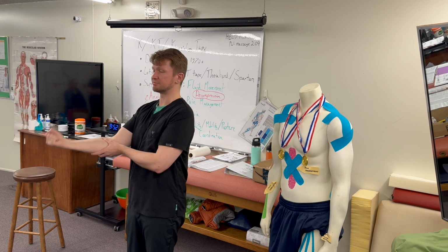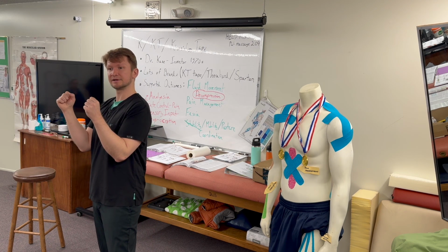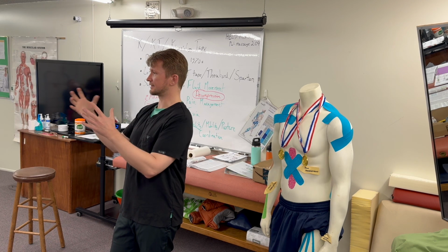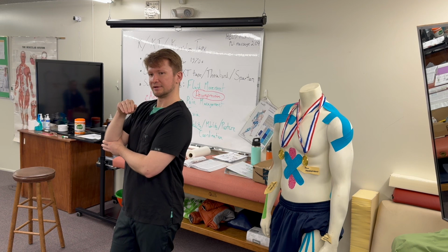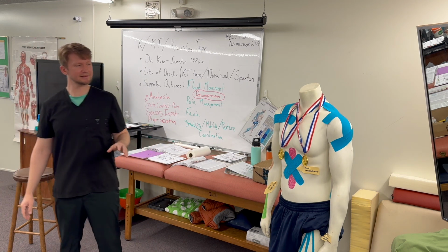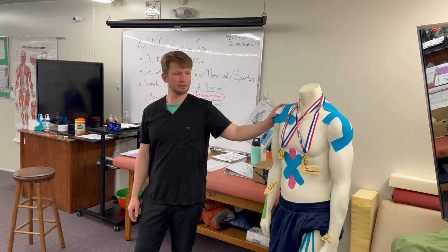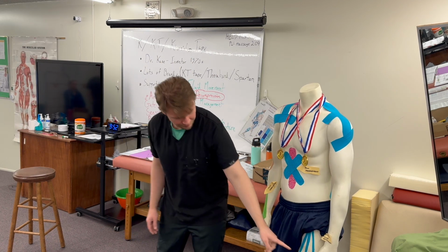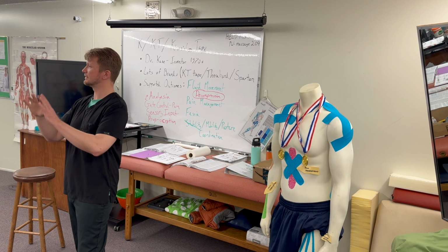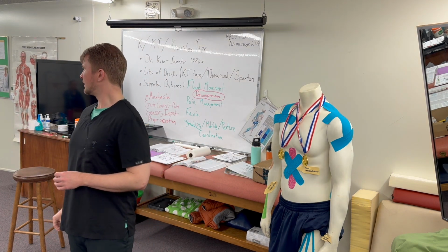And or the pressure changes created with muscle contraction and joint movement. Every time I contract my muscles, the tubes get squeezed a bit. So for veins, they use the muscle contraction and joint movement change to act as a way of opening those ducts and letting the fluid go. So especially for lymphatics, any kind of edema, that's probably in the end the most complex stuff to tape, the stuff around joints. It's the one that takes the most practice, but the one that has a ton of research behind it is this one. And you don't have to worry about going past joints, and even if you do, it's okay. It doesn't have a lot of tension. There's small strips of tape. It's really safe. You barely feel like there's anything on there. It's a wonderful thing.